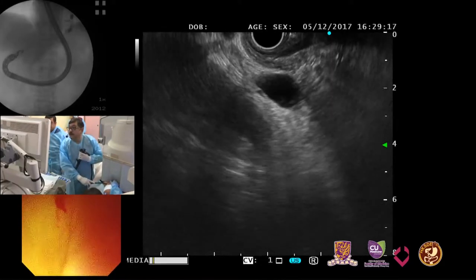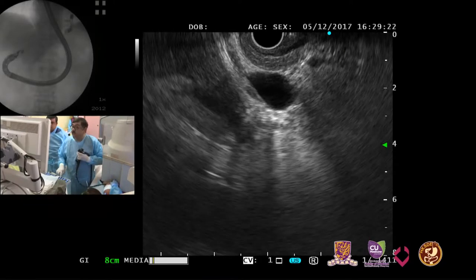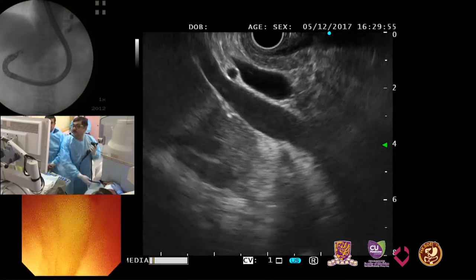So, and then I'll show you one thing. See here, this is the duodenum. Can you see this? Yes, we can. And there is another fold of duodenum here. Can you see? Yes. So now if I puncture, I'm going to do a double puncture. So this is wrong. So always see that you have a proper duodenal wall and bile duct and don't have this another fold of duodenum next to it. So this will be a double puncture going through the duodenum 2 times.